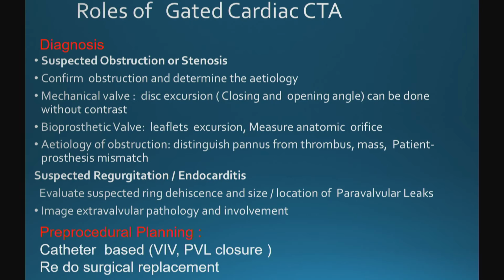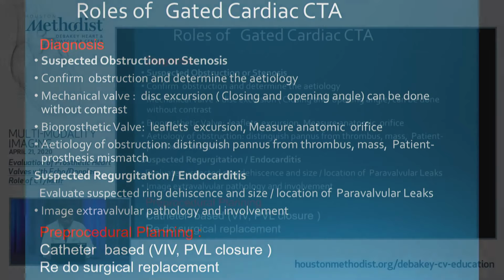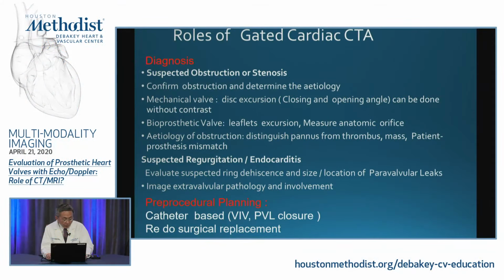So what are the roles of cardiac CT? I think there's two main components. One is for diagnosis, and the other one is for pre-procedural planning, which is another whole topic, so I'm not going to mention too much.